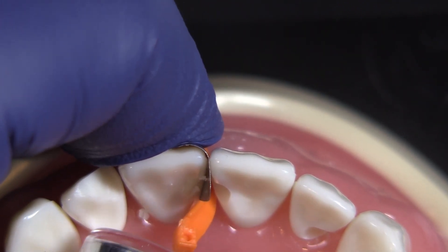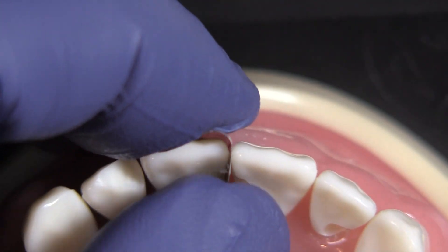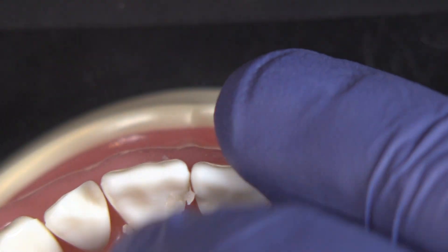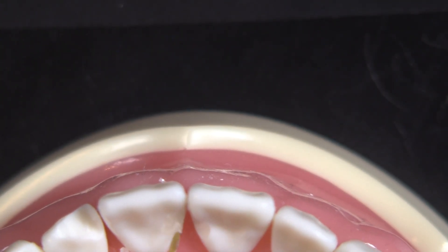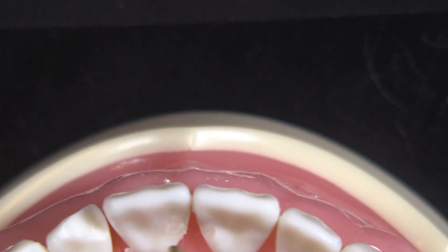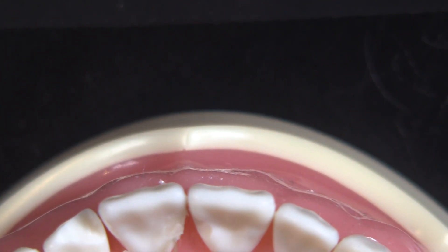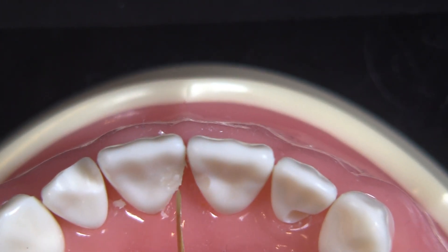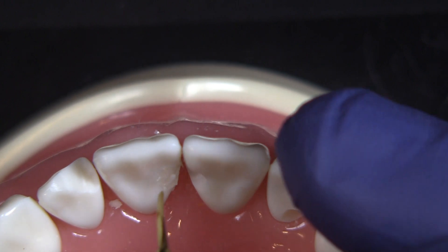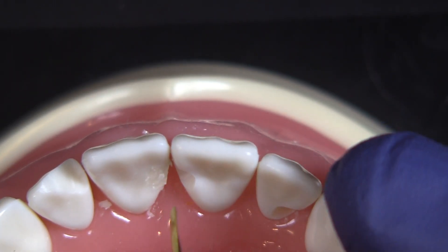You can see we're easily accessing it. And then usually we'll take everything off. If I need to have the assistant cure again, she could have that light directly behind there, if I felt like for whatever reason we needed a second cure on there. But that's pretty much the way that we'll restore the lingual of one of the upper anteriors.